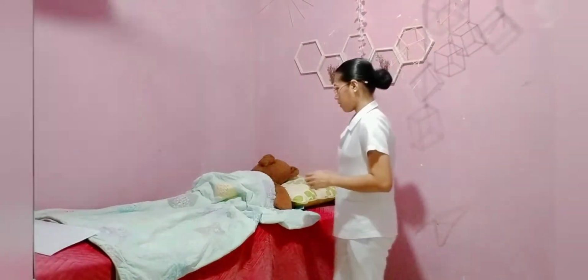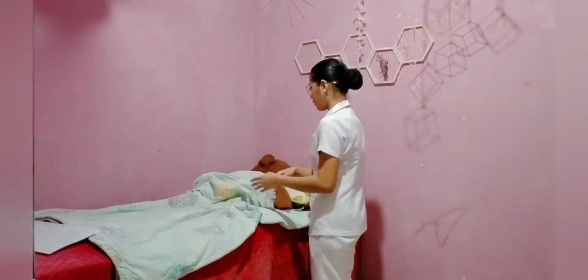After that, drape the patient, exposing only the area to be used. This is to avoid chilling and to lessen the embarrassment. So, ma'am, we will expose only the perineal area.